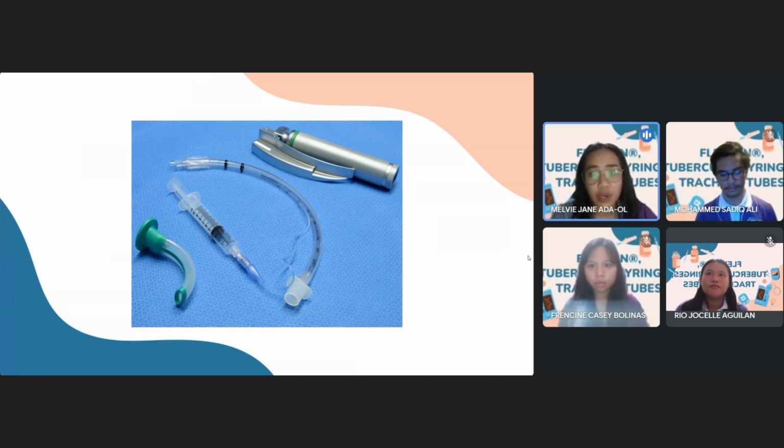The patient's airway can be secured using this, which is inserted either orally or nasally, enabling both controlled and spontaneous ventilation. The PVC used to make the single-use plastic tubes might be siliconized, ivory, or clear. This also contains a radio-opaque line running along its length, which allows its position to be seen on chest X-rays because plastic is not radio-opaque.